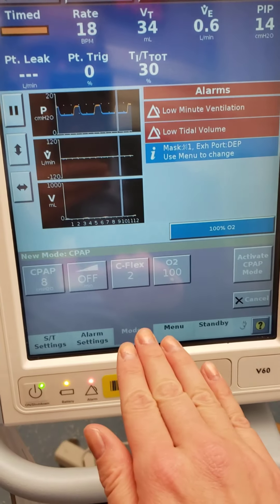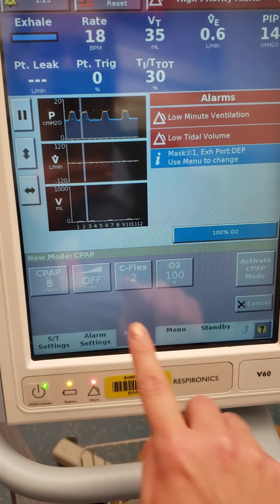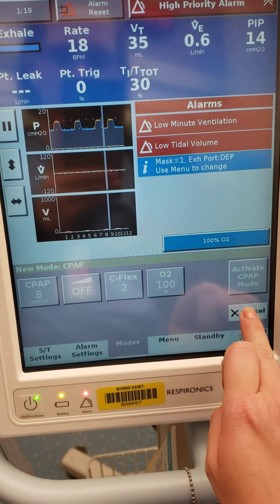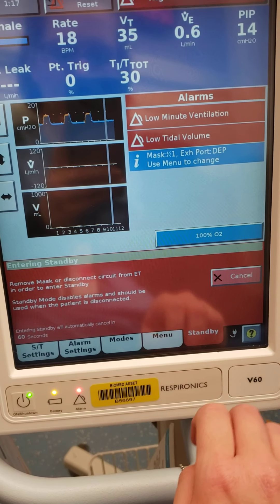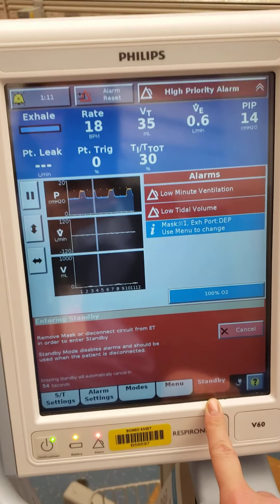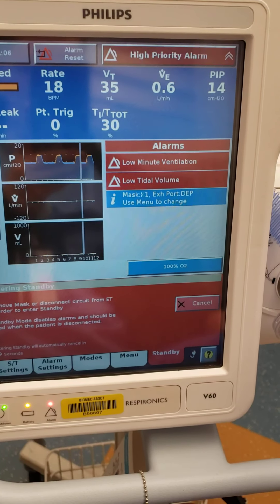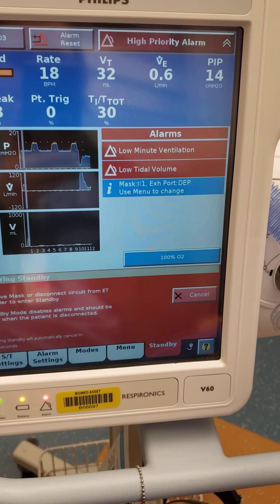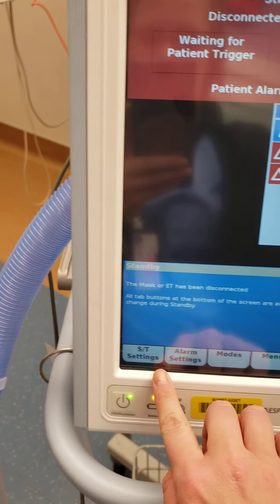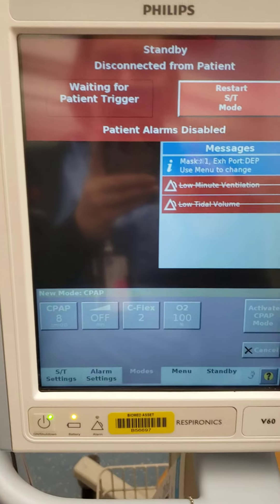CPAP is one continuous pressure — just one pressure we're delivering to our patient. I'm going to put this in standby so it's a little more quiet for you guys. The standby button basically makes it so we don't turn the machine all the way off, but it's just in a state of readiness — ready to go whenever. So back to our modes: CPAP is one continuous pressure.